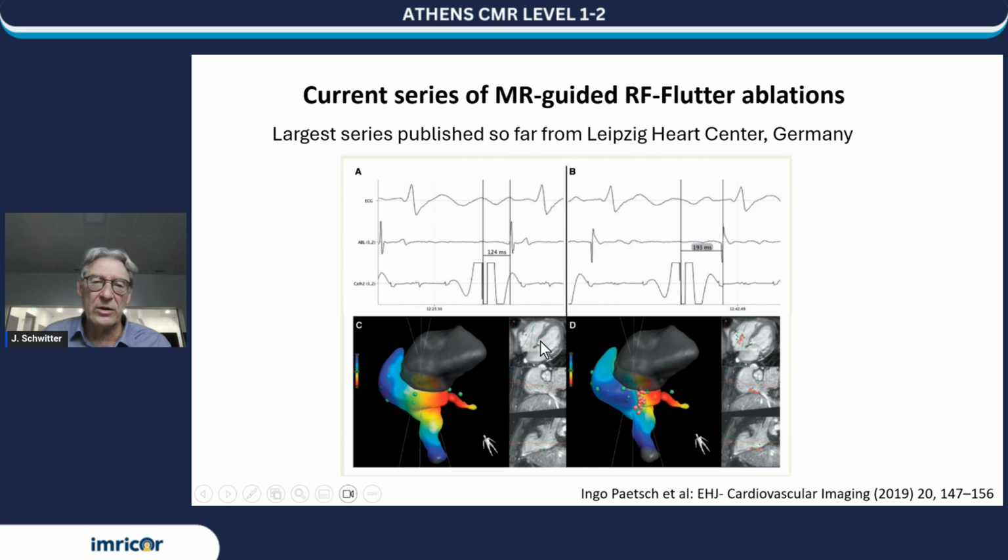This is one of these measurements with more than 100 milliseconds difference. If you stimulate here, and measure here, and you stimulate here, and you measure down here.